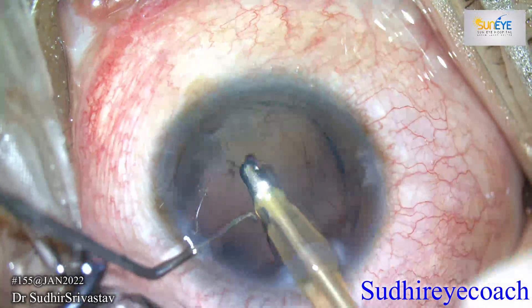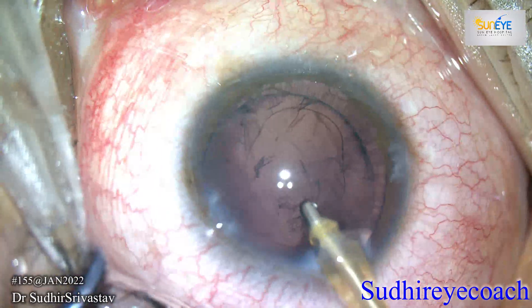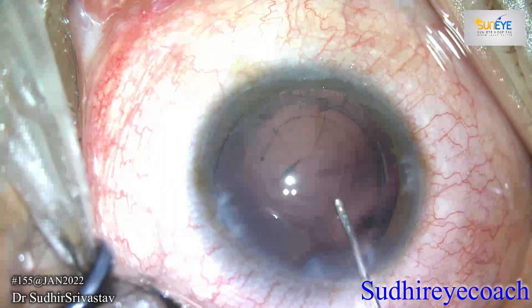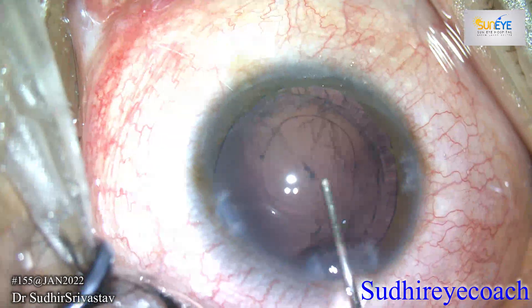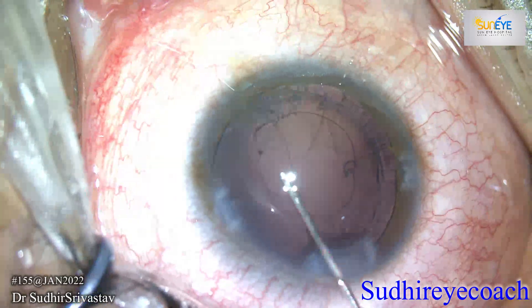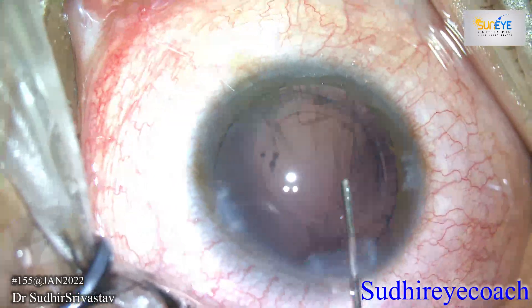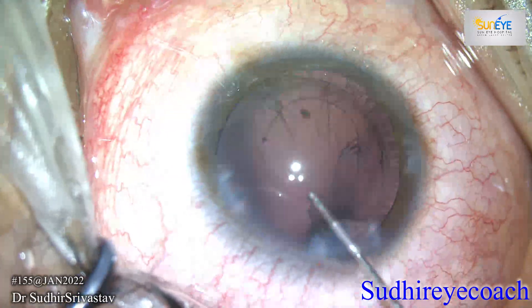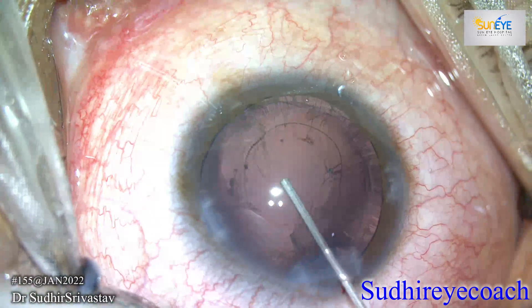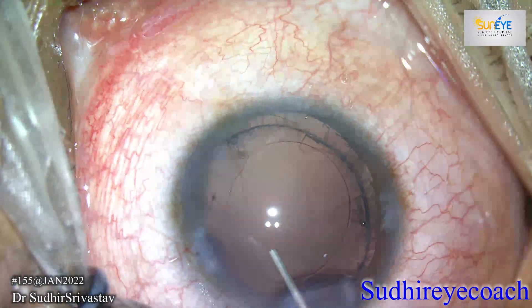Finally, I cleared all nuclear and cortical matter without any vitreous mobilization. I used a hydrojet technique to remove the sticky cortical fibers from the posterior capsule. Finally, I filled the whole bag with high-viscosity viscoelastics.